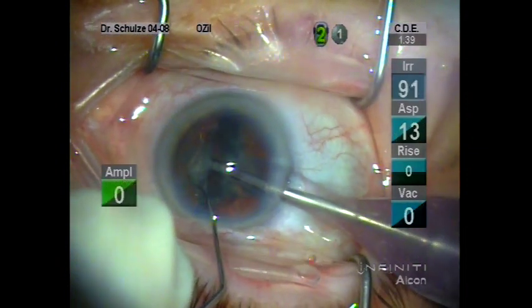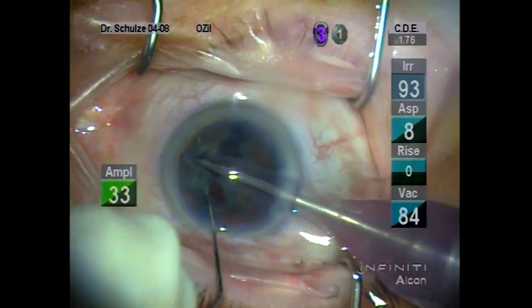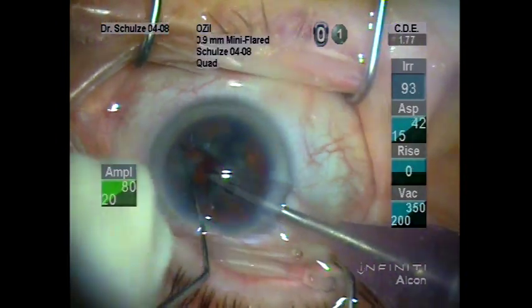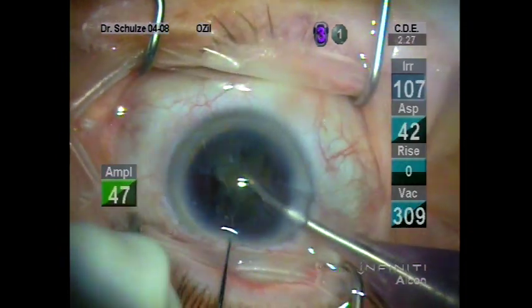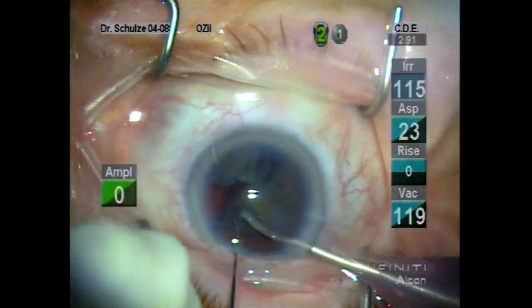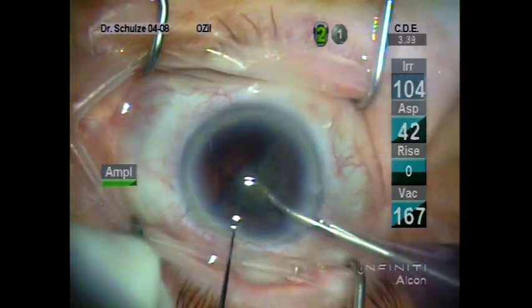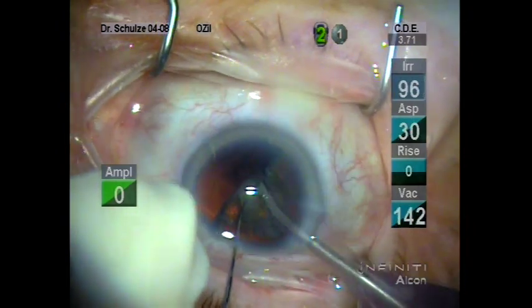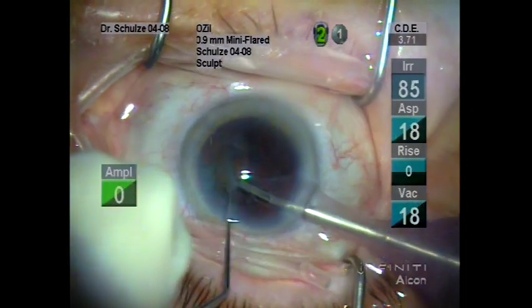Having made our initial groove, we split the nucleus into hemispheres and then rotate 90 degrees. I just make a tiny notch into each hemisphere, just enough to get purchase onto the segments with the Becker nucleus rotator and the FACO tip. We're using the 45-degree mini flare here, and once the hemispheres have been separated, we elevate the apex of the segment with the Becker nucleus rotator, engage with the tip, and emulsify the nuclear material.